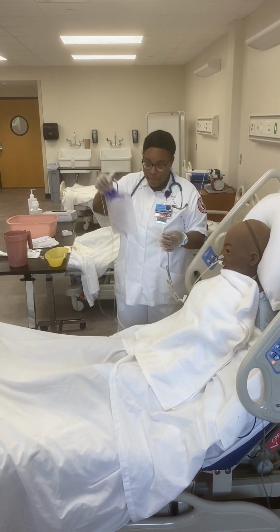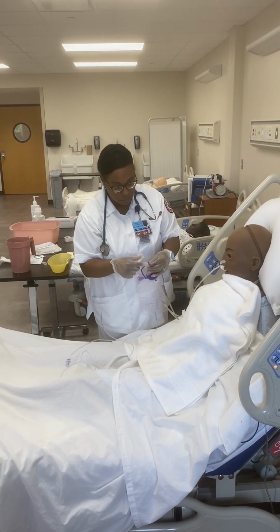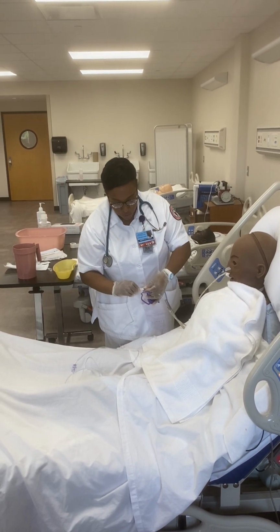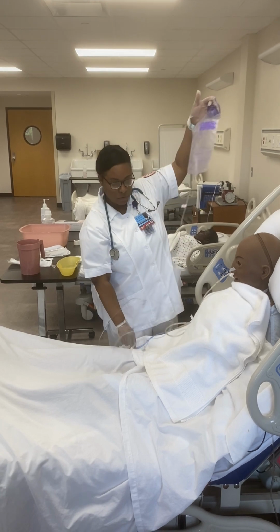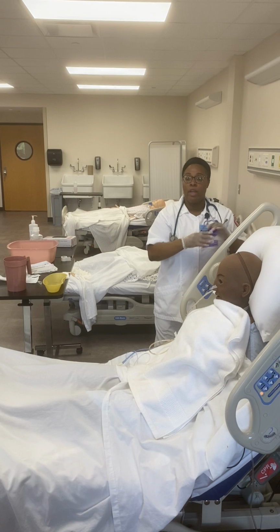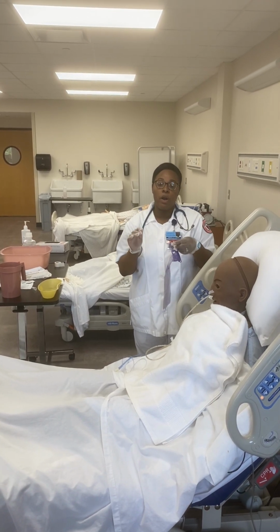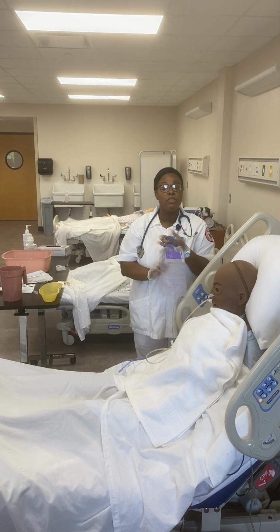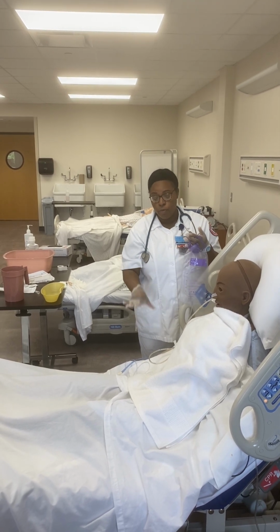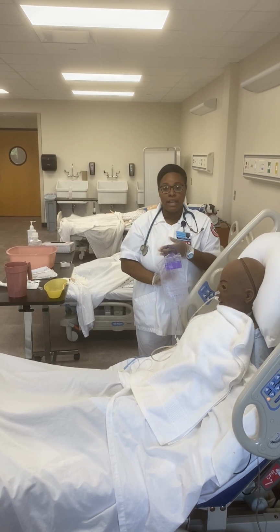I then will connect the feeding to the NG tube and set the feeding to the prescribed order. With enteral feeding, you need to flush with 30 mils of water before you instill the feeding and after you do the feeding and after medication administration.